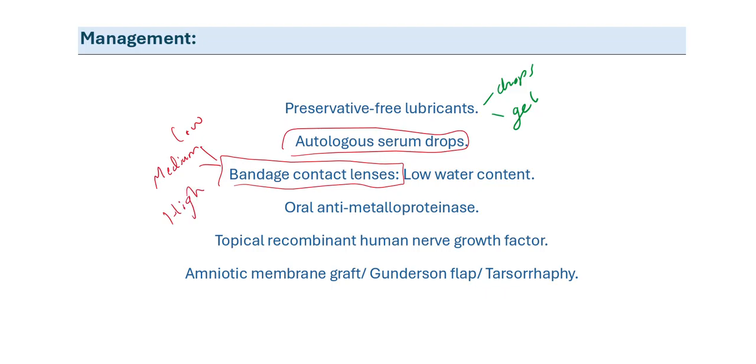So, in contrast to what the name means, low water content bandage contact lenses provide more moisture. It's more lubricating. It resists dryness.